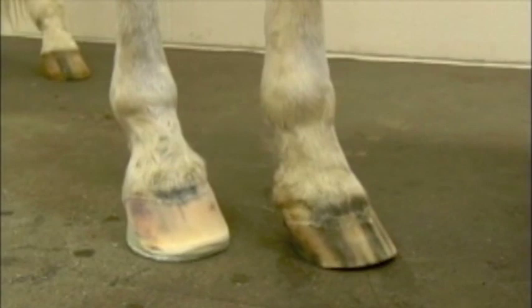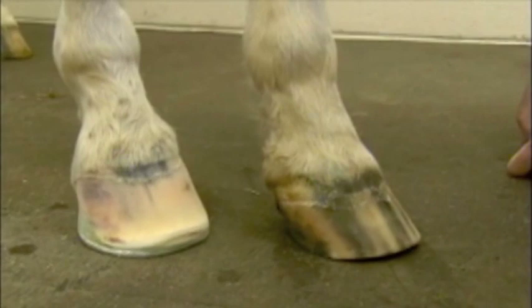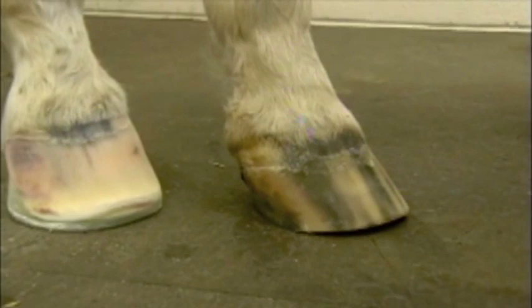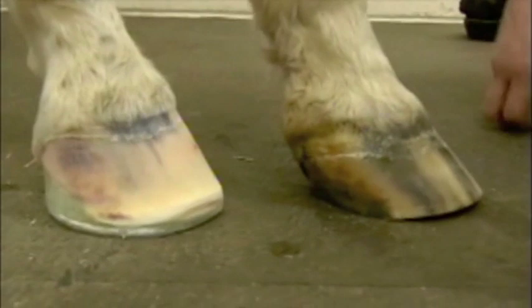For this foot we're going to use an indirect gluing method. We're going to use a Sigafoose shoe that we made - shaped up for him with a hospital plate on the bottom. He has some chronic infections on this medial heel. A Sigafoose shoe has an aluminum shoe with a fiberglass cuff attached, and we're going to use that cuff to glue the shoe to the foot. That cuff will allow his heels to expand and contract a little bit. He's really contracted on this heel - a really contracted inside heel - so I didn't want to lock him in with a direct glue shoe. We're going to use an indirect gluing system just to give those heels a little more flexibility.